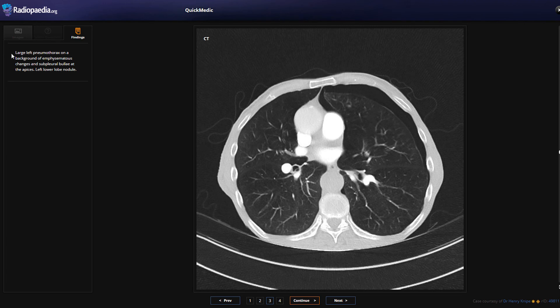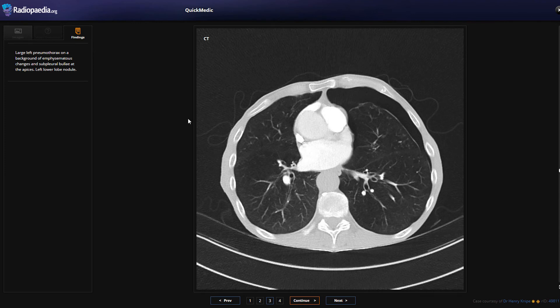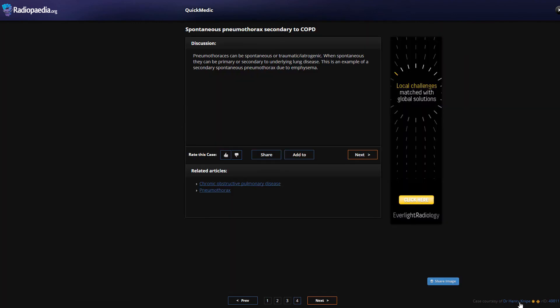The CT scan findings are a large left pneumothorax in the background of emphysematous changes and subpleural bullae at the apices, with a left lower lobe nodule. As noted in this case donated to Radiopaedia by Henry Knipe: pneumothoraces can be spontaneous, traumatic, or iatrogenic. When spontaneous, they can be primary or secondary to underlying lung disease. This is an example of a secondary spontaneous pneumothorax due to emphysema - the emphysematous changes caused weakness in the lining of the lung, resulting in a spontaneous pneumothorax.